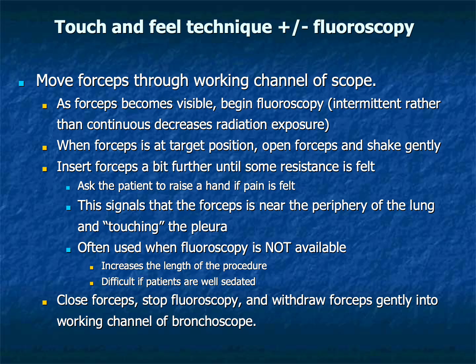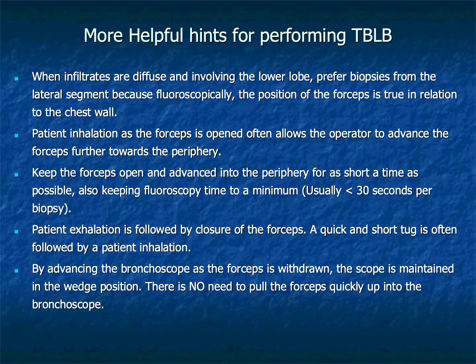And here's what the experts say. When infiltrates are diffuse and involve the lower lobe, prefer biopsies from the lateral basal segment because fluoroscopically, the position of the forceps is true in relation to the chest wall. Asking the patient to inhale as the forceps is opened allows the operator to advance the forceps further toward the periphery. Keep the forceps open and advance into the periphery for as short a time as possible, also keeping fluoroscopy time to a minimum, usually less than 30 seconds per biopsy.